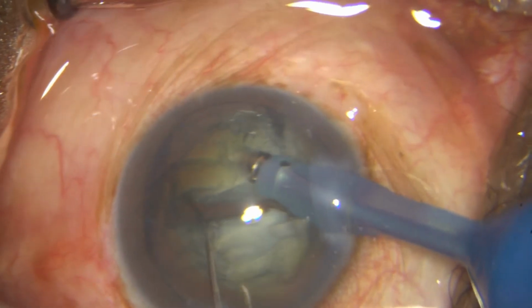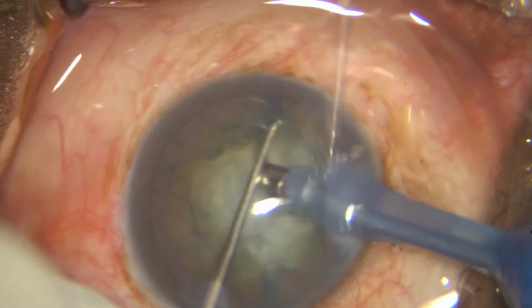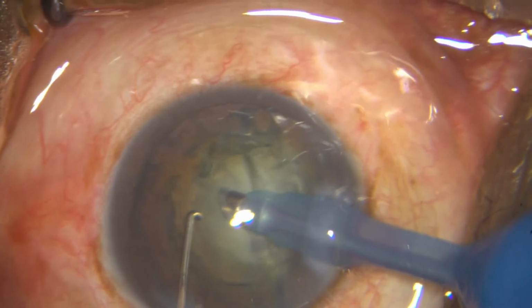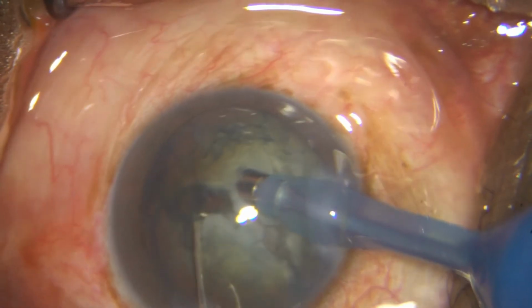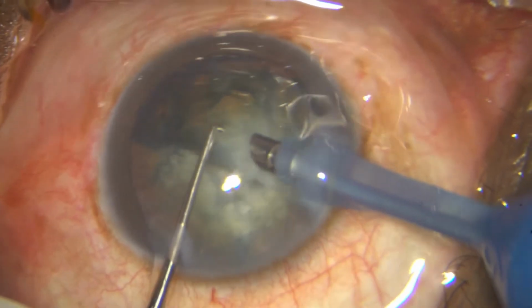And watch, this nuclear sclerosis is only in the central 3-4 millimeters. So don't go too far into the periphery. You'll go into the epinucleus and you'll be holding on to nothing. So just get enough and then chop. This is very, very important in these sort of cataracts.